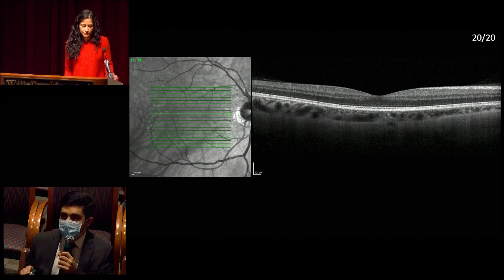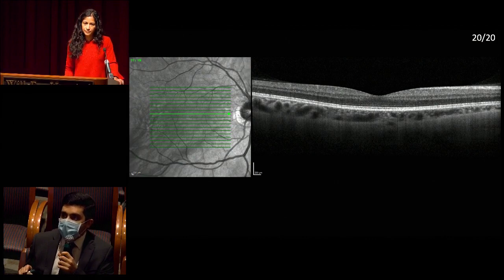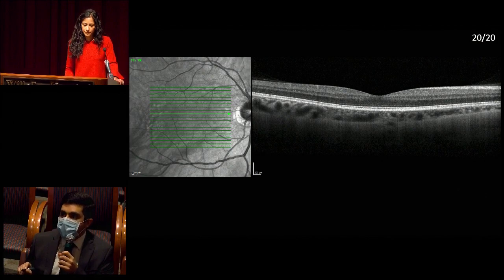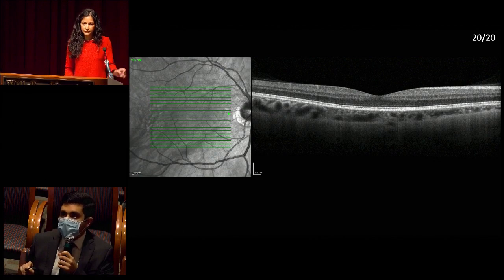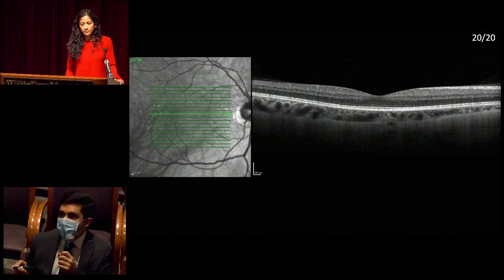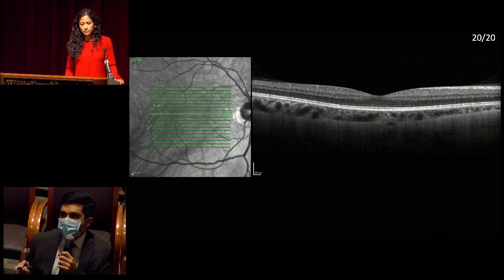Horizontal raster OCT through the right macula: the infrared image demonstrates the peripapillary atrophy. On the B-scan, vitreous is optically clear, hyaloid appears attached, the choroid has a somewhat thin appearance at least nasally, and retinal laminations appear intact.